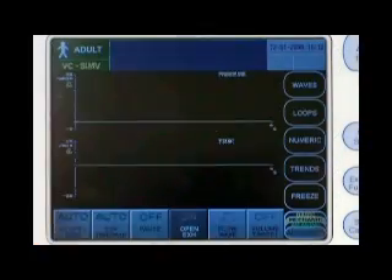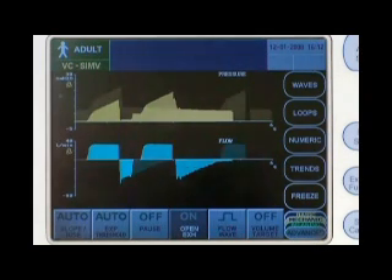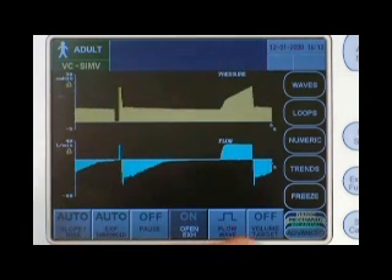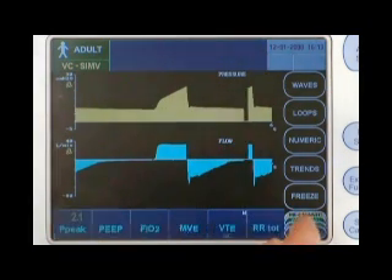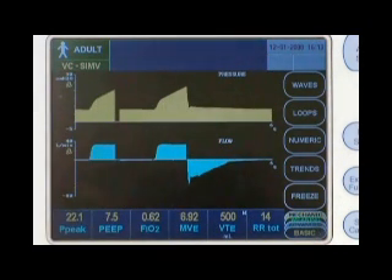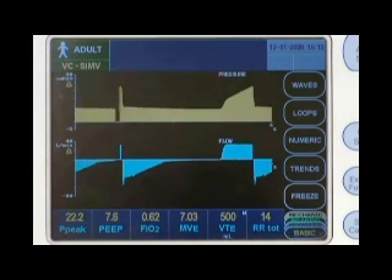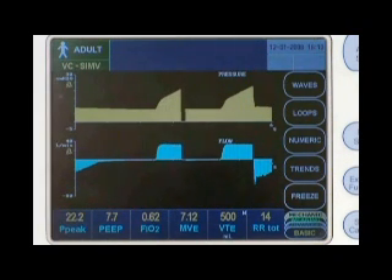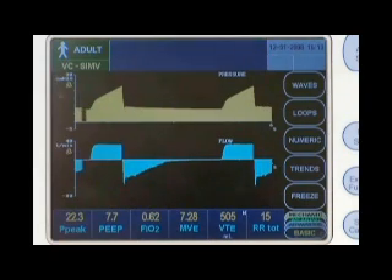I'll touch the start ventilating button to begin ventilation. Nearly all screens allow you to view the data sets along the lower margin. The basic data set includes peak pressure, PEEP, FiO2, exhaled minute volume, exhaled tidal volume, and total respiratory rate. During ventilation, the VTE display shows an M for mandatory or S for spontaneous with each breath.